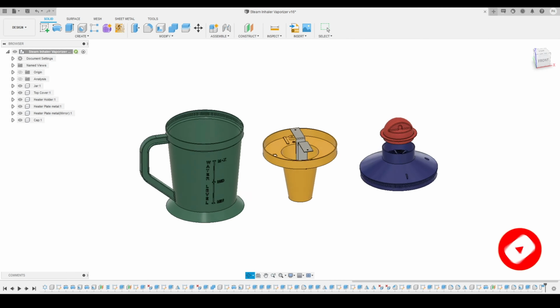So this is what we got. This is a complete solid kind of jar right now without any further details. It's a very simple design I had created using Fusion 360 just by using one revolve tool and a sketch. Here you can see Sketch1.